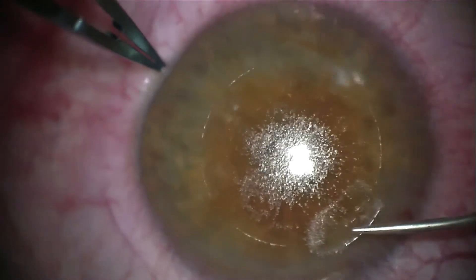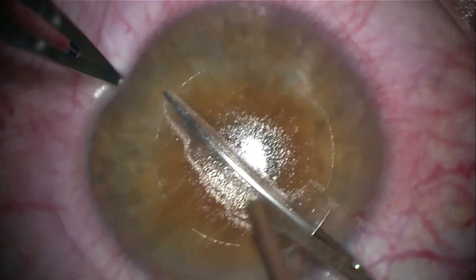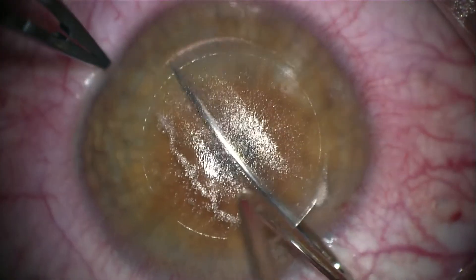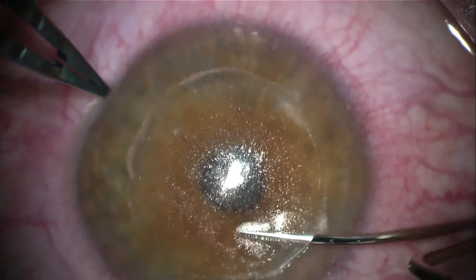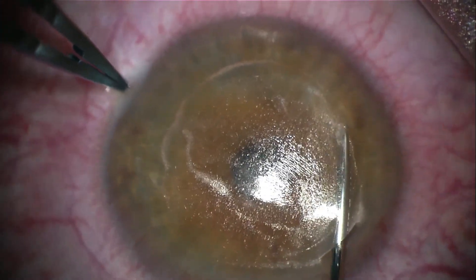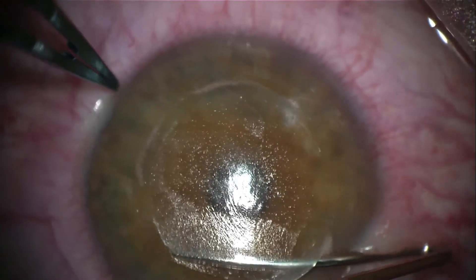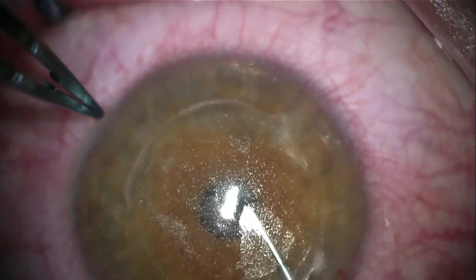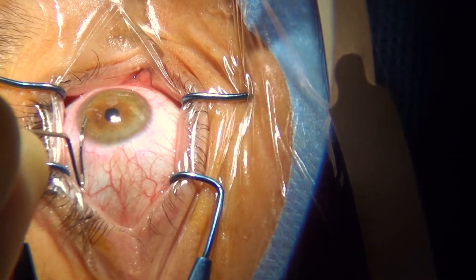So now in real time, the same surgery from another angle.